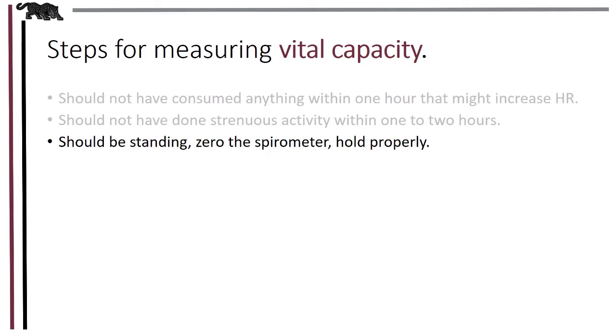Then there are small holes. You may remember the illustration a few slides ago. There are small holes on those spirometers. You don't want to cover any of those up either. They shouldn't be covered up. So you just hold the base of it.